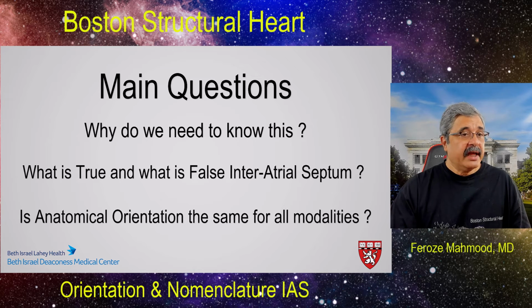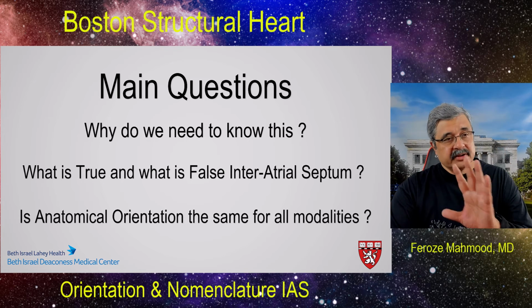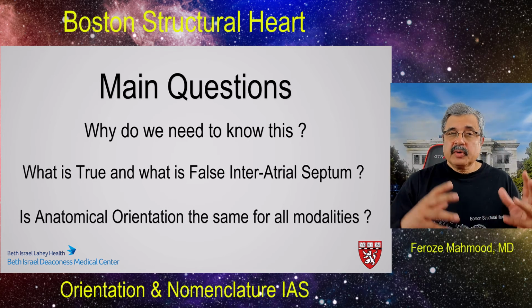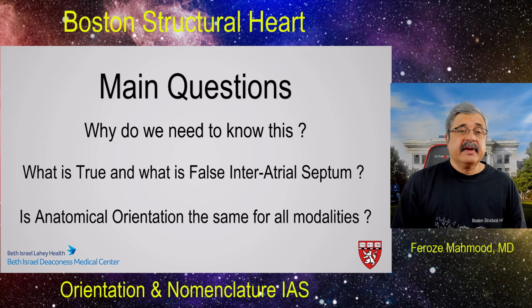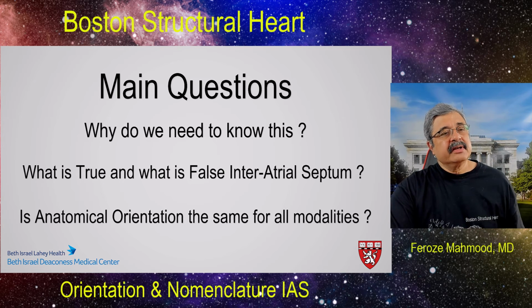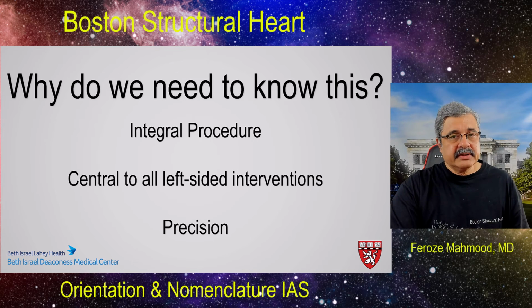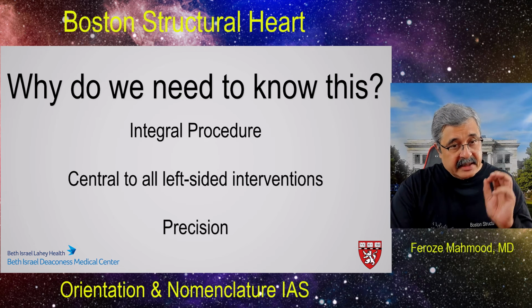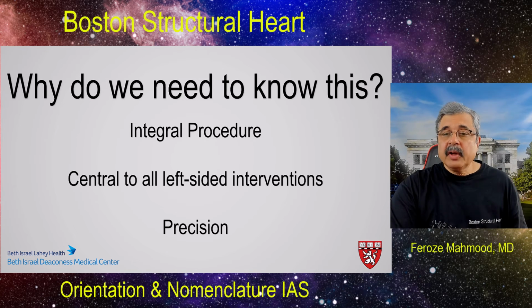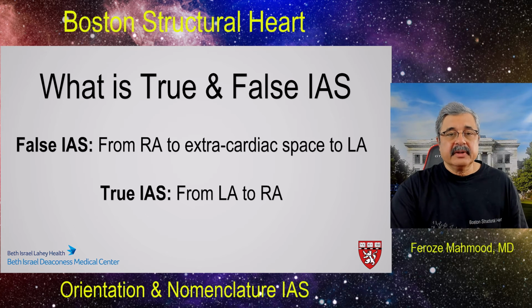Is it the same for all modalities? No, it is not, because it is quite different. One is a projection, one is a tomographic display, and therefore to reconcile them is very complicated. Therefore, it's more important to be very precise in your guidance during transeptal puncture and other techniques about what you refer to as your reference points. Why do we need to know this? Because septal puncture is an integral procedure. It is central to all left-sided interventions, and precision is an extreme requirement during this.